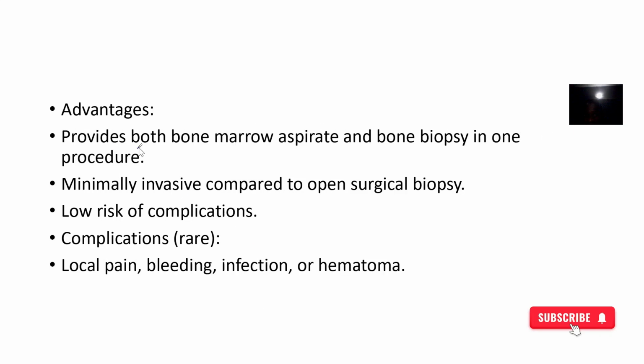The advantage is that it provides bone marrow aspirate and bone biopsy. For the procedure, complications could lead to pain, bleeding, infections, and hematoma if not done properly.